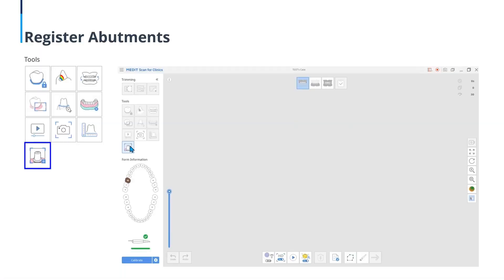We're going to move on to our next updated feature. A feature has been added to register an abutment as a library. Before updating to add an abutment library to MetaLink, users had to receive a custom abutment from a lab or take it directly from a tabletop scanner and register it as a library. Or they had to create a case and scan the abutment, then export it as a mesh file. But with this new abutment registration feature, the clinic users can scan the abutment with an intraoral scanner and register it as a library much easier.